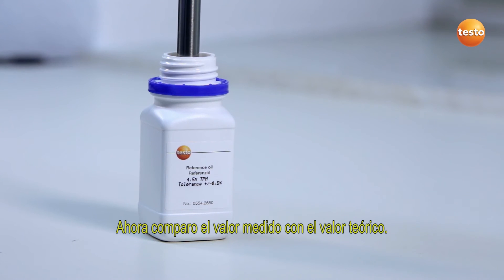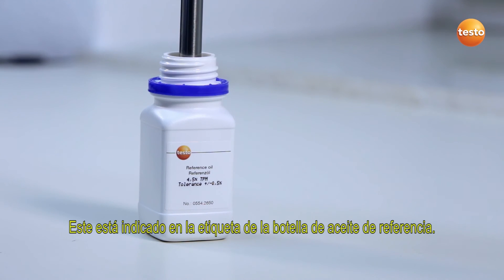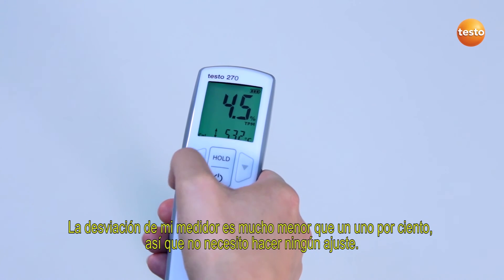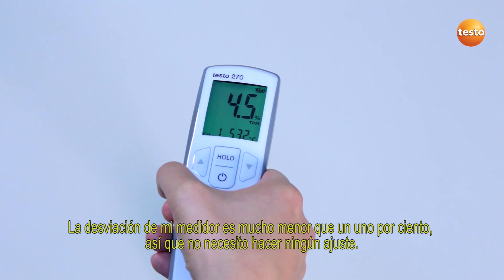I now compare the measurement value with the target value. This is stated on the reference bottle label. My tester's deviation is considerably less than 1%, so I don't carry out any adjustment.